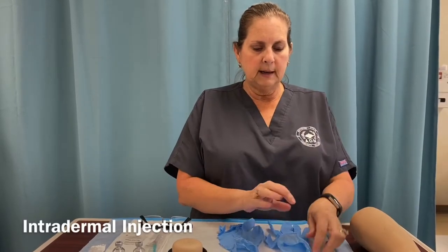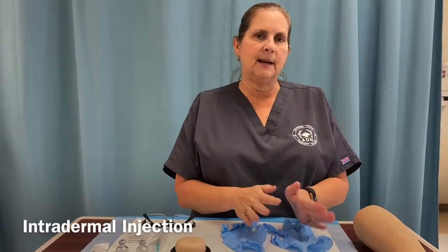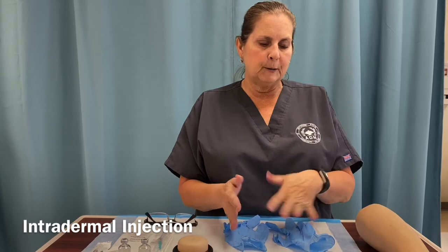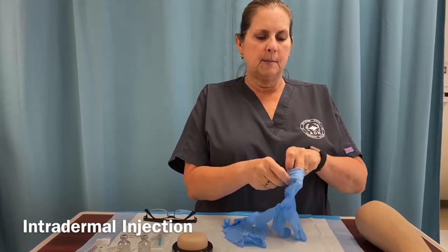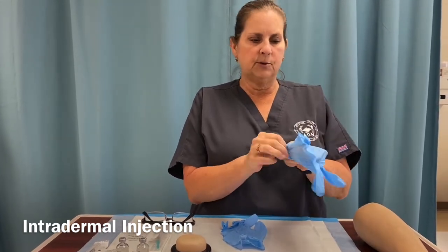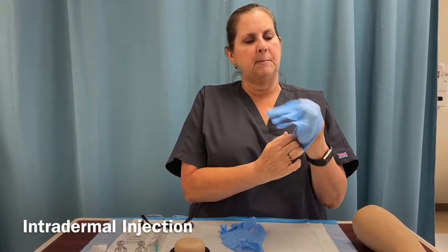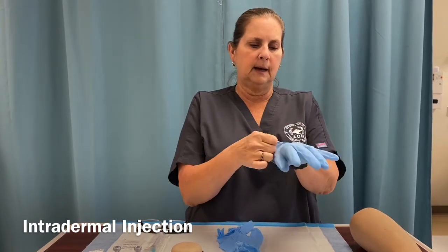So typically you'll be getting your injections ready in a medicine room. You always want to make sure it is not a sterile procedure, so you will just be putting on regular gloves.